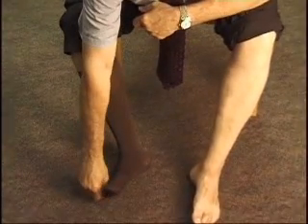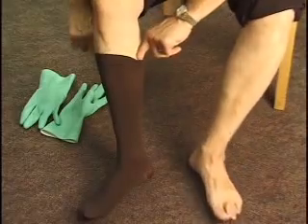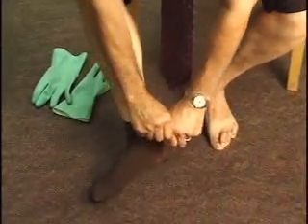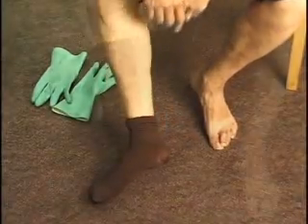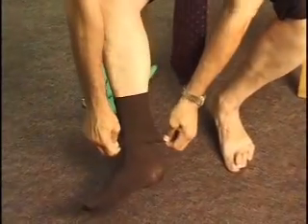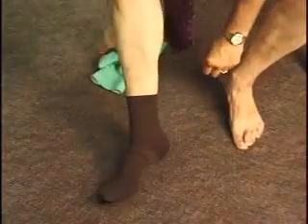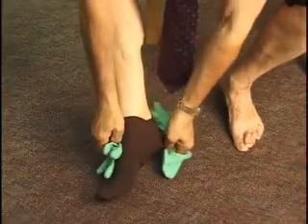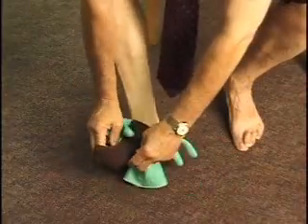Here we see an improper removal of the stocking, bunching it all up at the ankle. This is both difficult to do and is hard on the stocking and the applier and should not be done. Instead, the stocking should be folded over in a single layer down over the heel and then removal facilitated by gloves in order to avoid damage to the stocking.